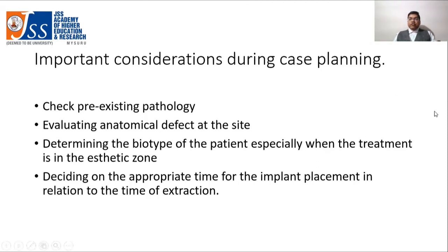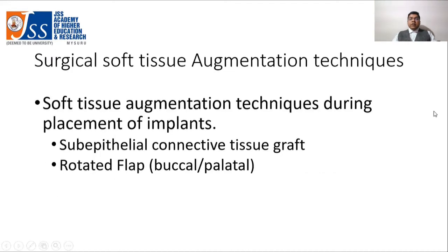Many of the soft tissue complications can be prevented if it is assessed at initial stages, and if there is some deficiency of soft tissue, it can be augmented at the time of placement of implants. These are the few techniques which can be employed during placement of implants.